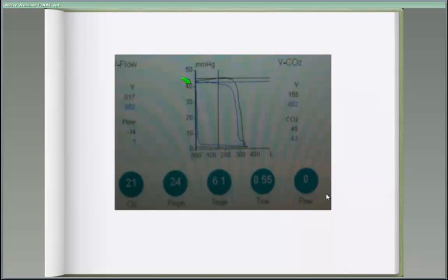Now we switch these animals over to APRV before we do the experiment, and you can see that there is actually very little dead space. In fact, one of the things that APRV differs from conventional ventilation is it uses diffusion and convection, not just bulk ventilation or convection. And you can see that the CO2 rises immediately because there's less dead space, because during that breath hold, you actually equilibrate more CO2. Previous published studies and more recent studies suggest that CO2 is more efficiently managed with APRV. We typically see much lower minute ventilations. Again, potentially decreasing ventilatory stress.